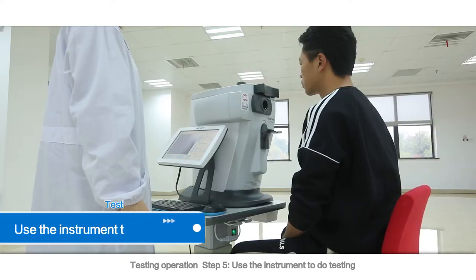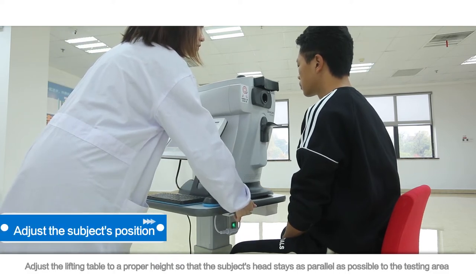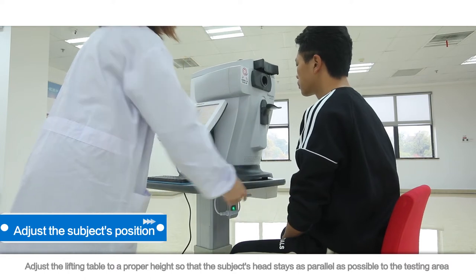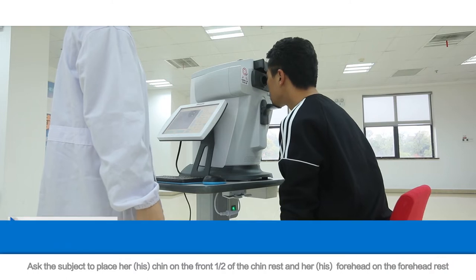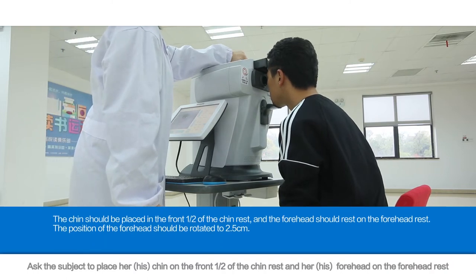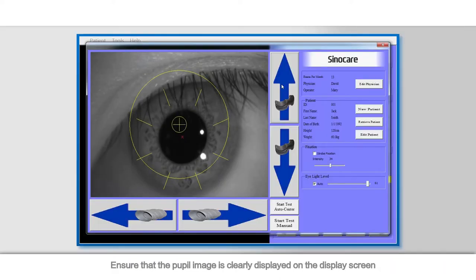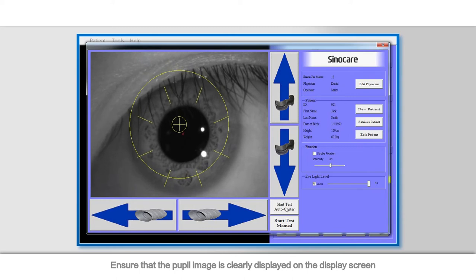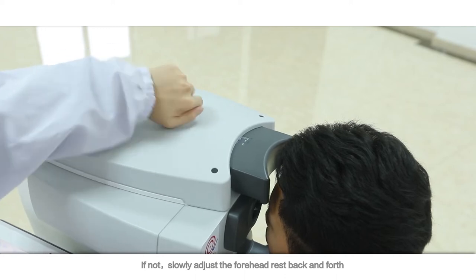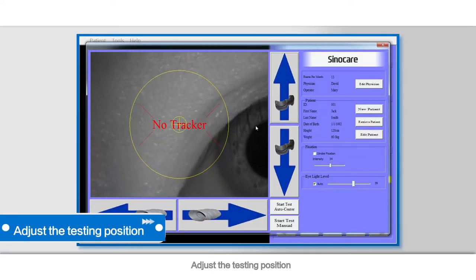Sit up straight when facing the front, with the head undeflected and fitting the chin and forehead rest naturally. Testing Operation Step 5: Use the instrument to do testing. Adjust the lifting table to a proper height so that the subject's head stays as parallel as possible to the testing area. Ask the subject to place her or his chin on the front half of the chin rest and forehead on the forehead rest. Ensure that the pupil image is clearly displayed on the display screen. If not, slowly adjust the forehead rest back and forth.